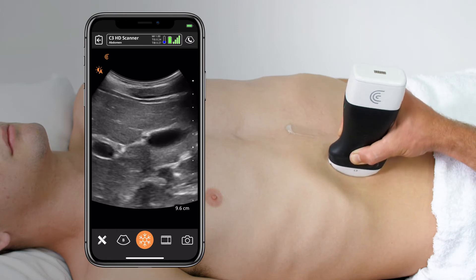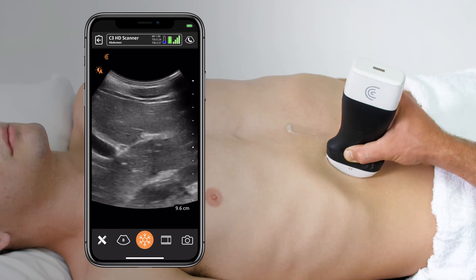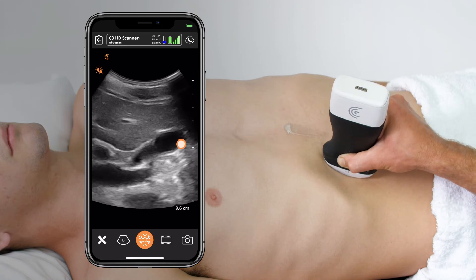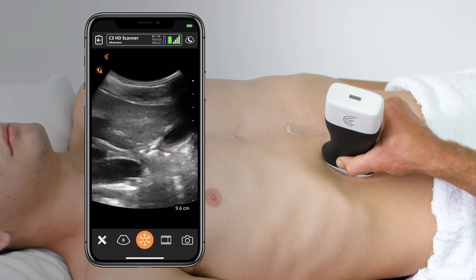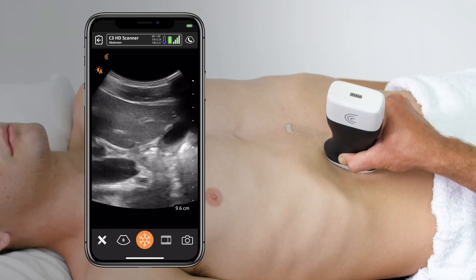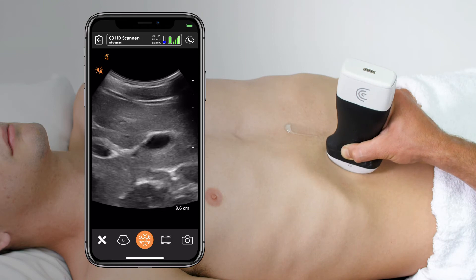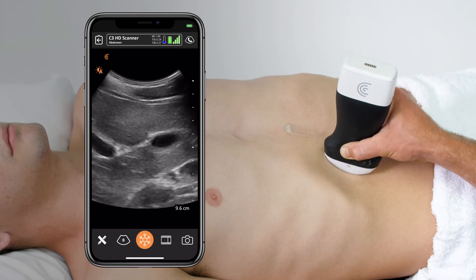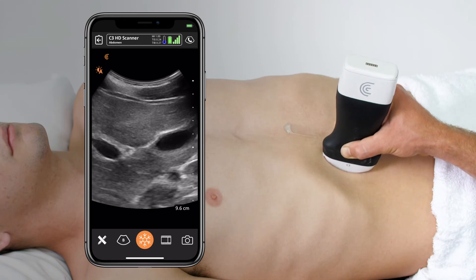I'll rotate the transducer 90 degrees and do a second sweep to get a second plane through the gallbladder, making sure I sweep through the entire body of the gallbladder, especially paying attention to the neck.